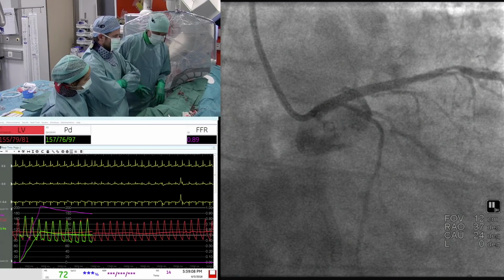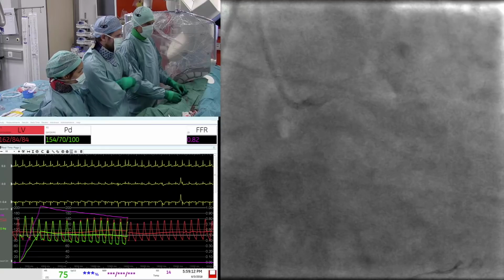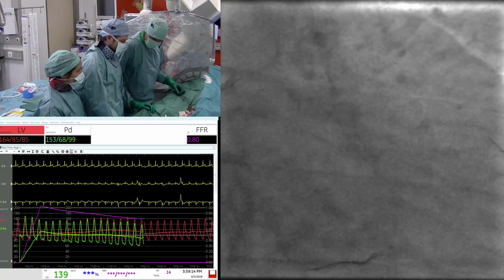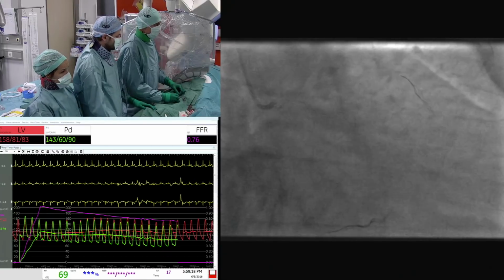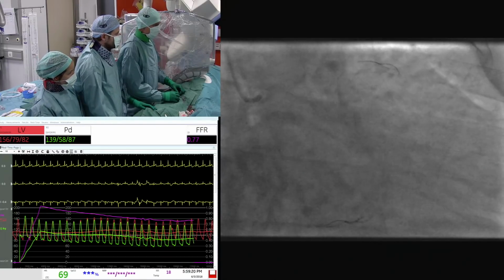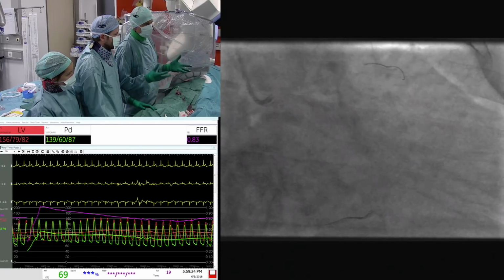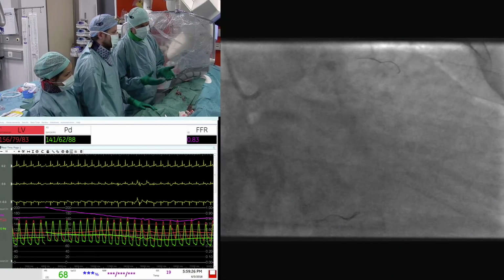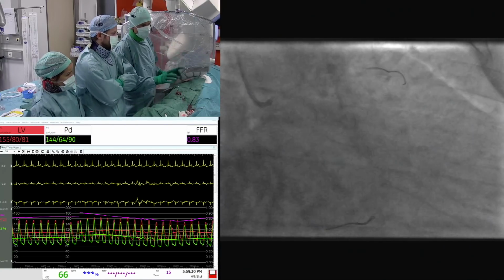But it's better to do the OCT at the very end, if you agree, Emanuele. Okay. Look, the pressure wire, despite all the manipulation, is still alive and kicking. And yes, come back. And we are going to see whether it's in a good shape to be equalized again.